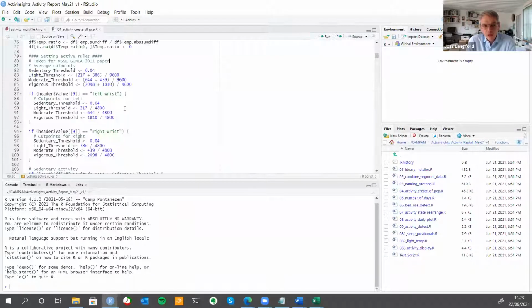I think what we've got here is some open source code for the community to use and to work with, and we are in the process of validating sections of that as we go. Charlie, I think, can tell you a little bit about the sorts of populations that the basic structure was created around, to give you an idea about where we are in different places on this.